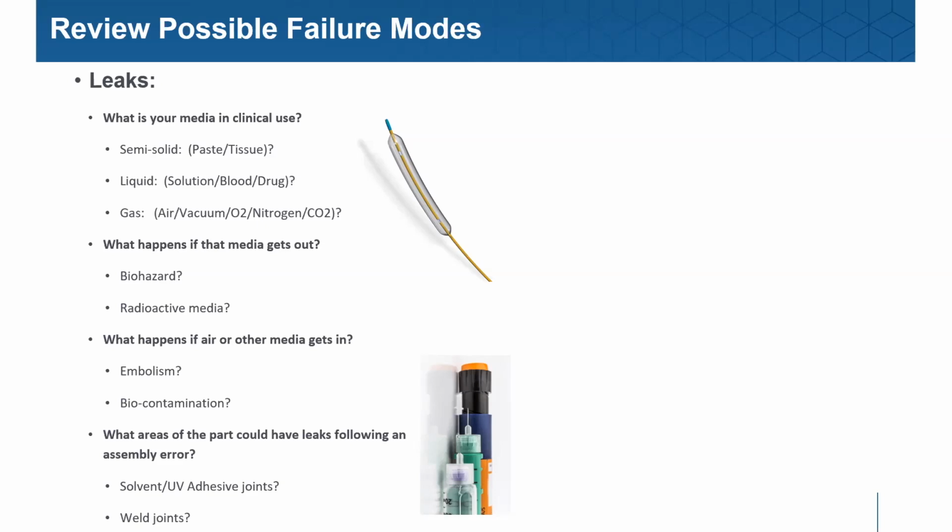Right. For example, there are trach balloons that are used when a patient is unconscious and intubated. The air pathway has this trach tube placed in, and then the balloon is inflated to hold its position. Well, okay, the balloon now is not carrying a liquid like it would be if it were a Foley catheter. So the media, being a gas, leaks faster.